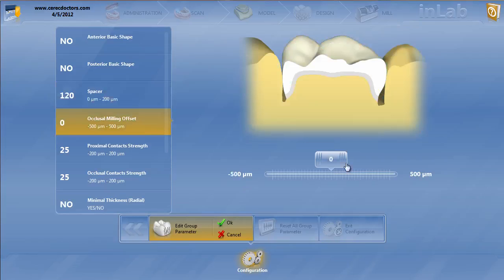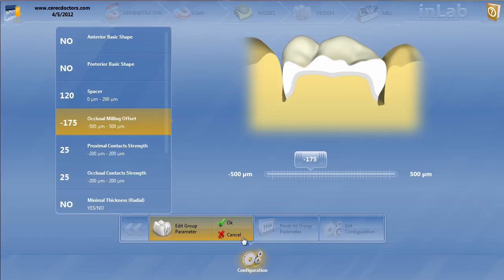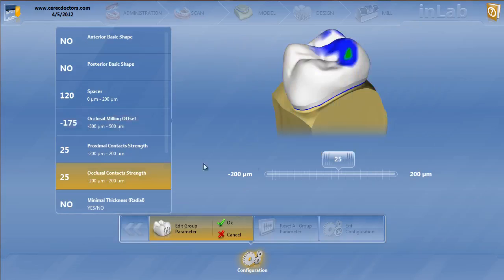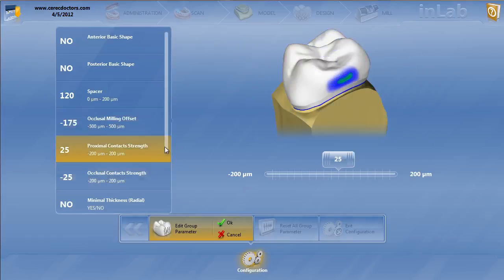Occlusal offset, you definitely want to have this negative 150. I even bump it to minus 175, because I always assume that those veneering structures are not going to fit absolutely perfect. They're going to need some adjustment, and usually my occlusion's a little off. Proximal contact strength at 25. Occlusal contact strength minus 25.